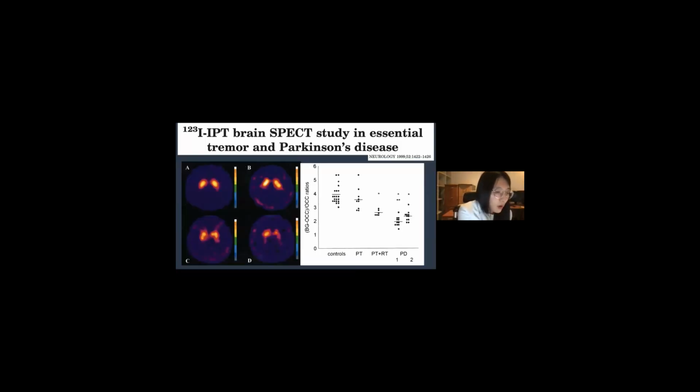But tremor is commonly observed in patients with PD and essential tremor. Unlike patients with PD, which shows resting tremor, patients with essential tremor, ET, usually show postural tremor, but some ET patients have overlapping symptoms mistaken for PD and receive anti-Parkinson treatment, unfortunately. Other DAT study investigated the role of DAT imaging to select potential candidates among the patients with ET who are likely to develop PD in the future.